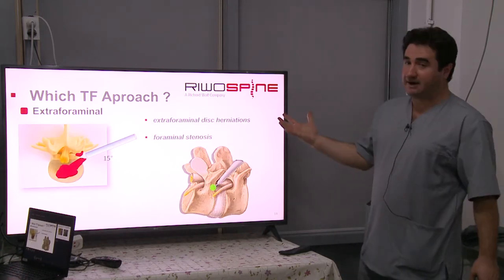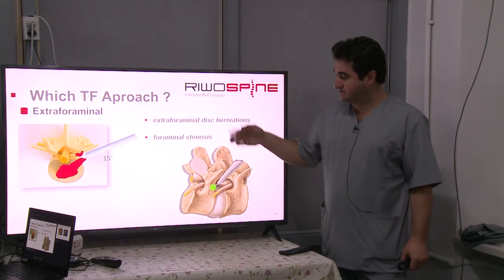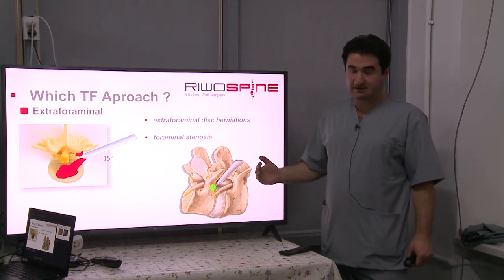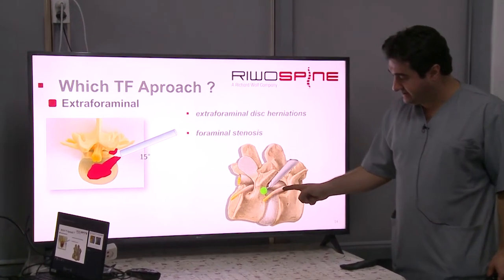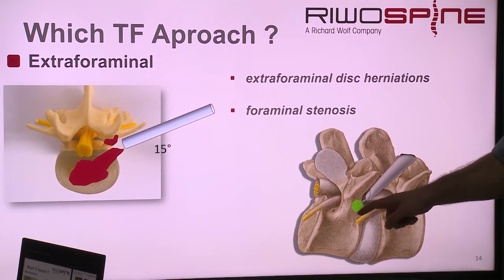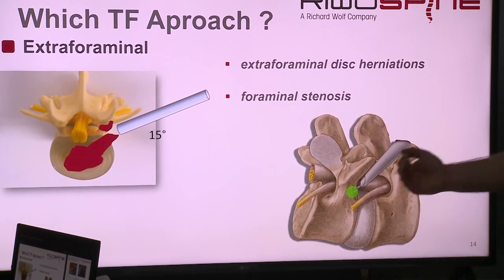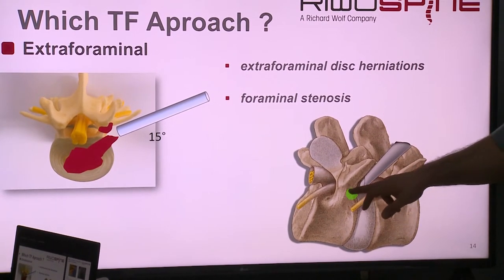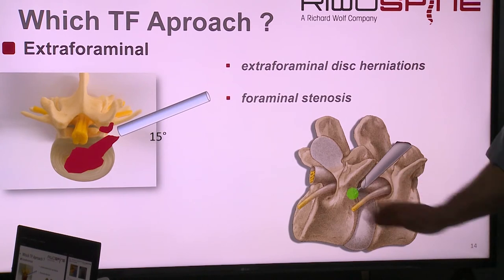Another approach we call the extraforaminal approach. Sometimes the pathology is located outside. For example, if there is a herniation, this herniation changes the position of the exiting nerve root. Then you cannot pass here. You have to stay outside. And what we do, we prefer to start on the caudal side here, at the caudal pedicle.